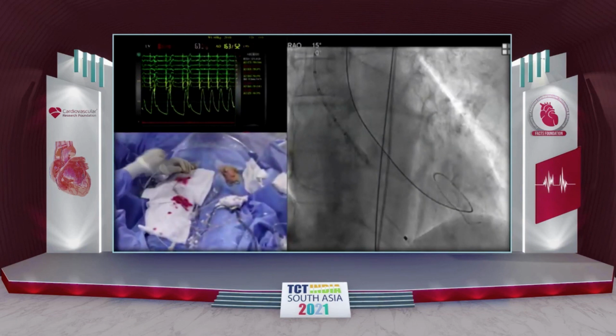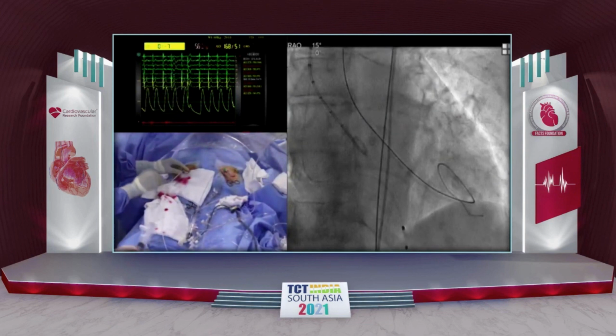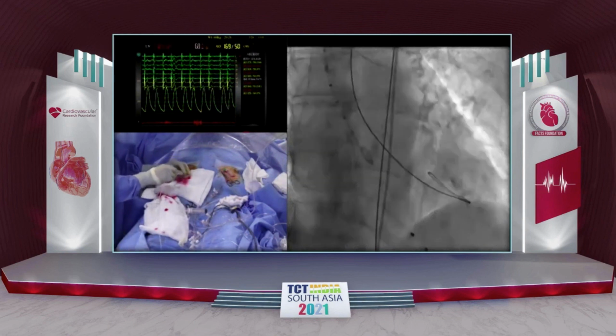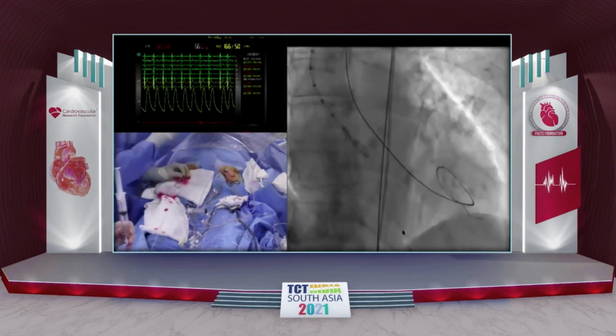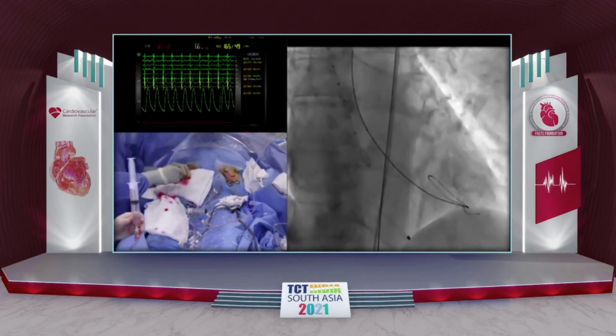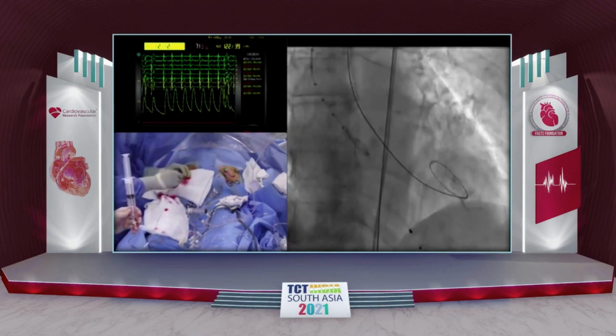Simple things, for example, I've connected a side arm flush to the side arm of the sheath we're using. So we're flushing the sheath constantly, which minimizes thrombus formation in the sheath. No matter how heparinized the patient is, there's always the risk of thrombus or clot migrating into the sheath. This allows us to ensure that you don't take thrombus with you when you're going up to the valve.